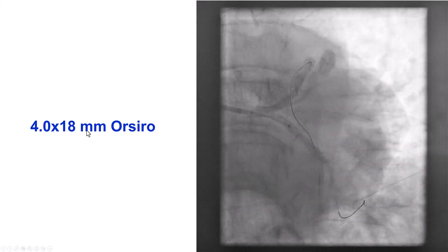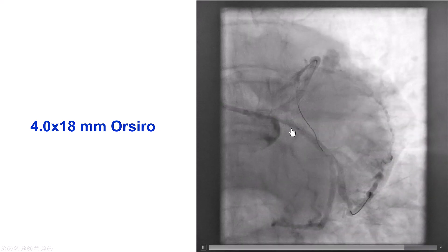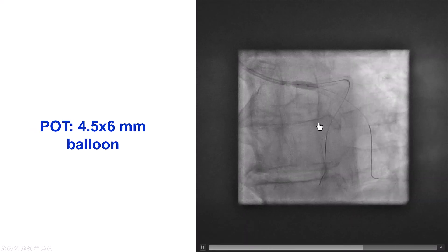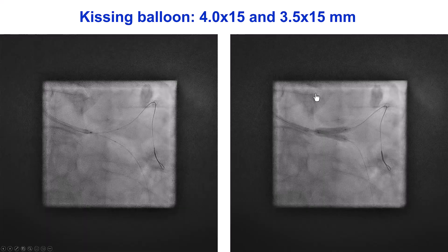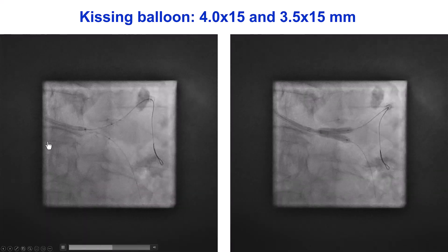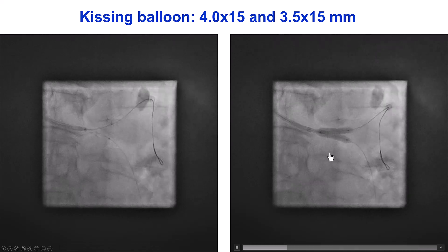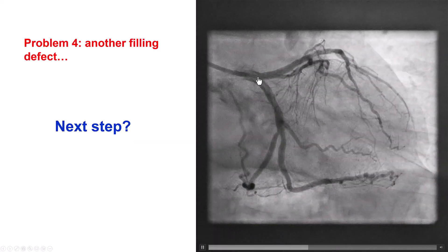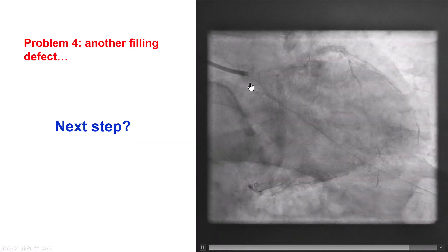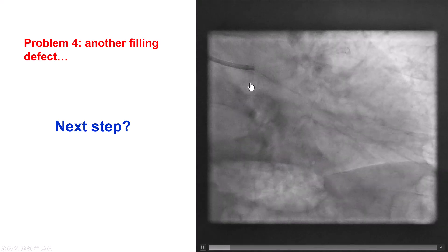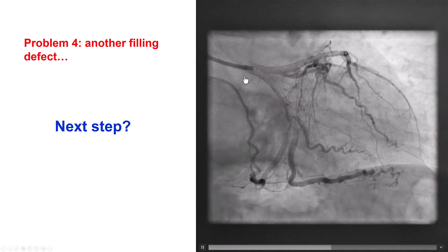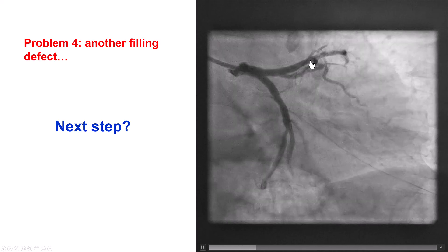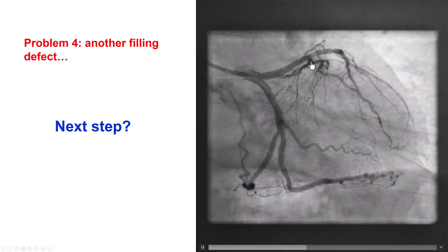A 4.0 by 18 mm stent was deployed across the ostium of the LAD. We did a proximal optimization technique, rewired the LAD, and did kissing balloon inflation. This provided an excellent result in the left main. But the problems did not stop — the same filling defects we saw now appear within the LAD stent that was recently placed.